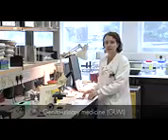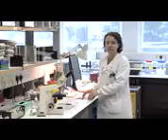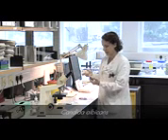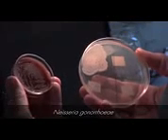This is the genitourinary medicine bench. Here we would culture vaginal swabs, cervical swabs, urethral swabs for the causes of vaginal discharge and urethral discharge and sexually transmitted infections such as gonorrhea. This plate shows Candida albicans, which is a cause of thrush. This plate shows Neisseria gonorrhoeae.